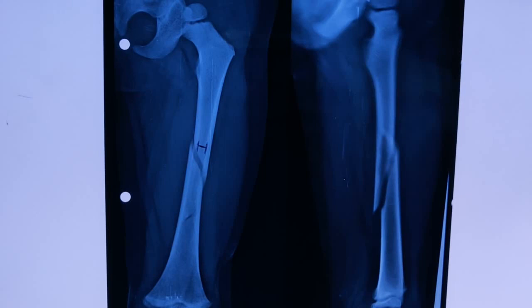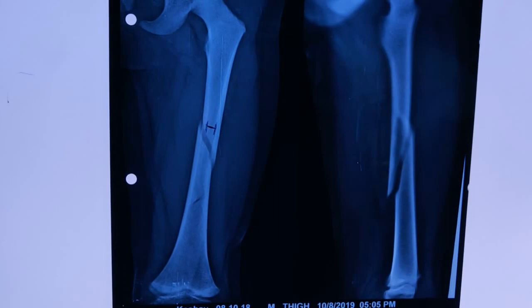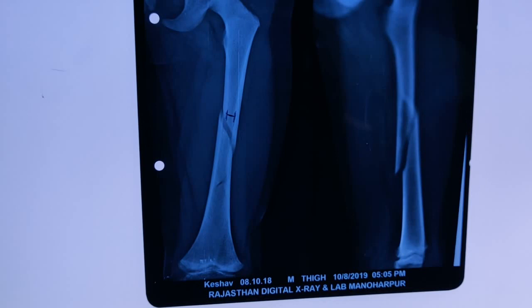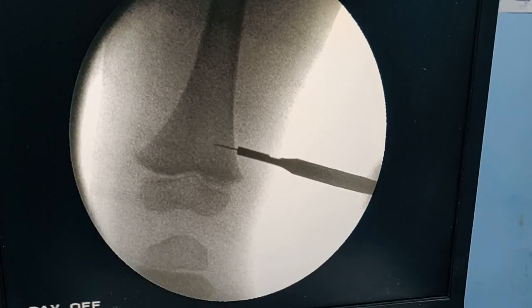For single bone fractures such as radius and ulna, you aim for around 60% canal fill. If this were the radius and I'm putting one TENS nail, I multiply 0.6 × 10 = 6mm, so I would use a single 6mm wire. This explains how to decide nail size. Always try to use two symmetrical nails — nails of the same diameter — to follow the principles of TENS nailing correctly.